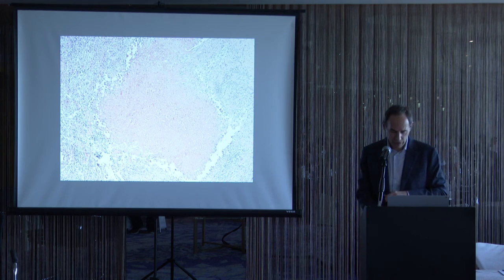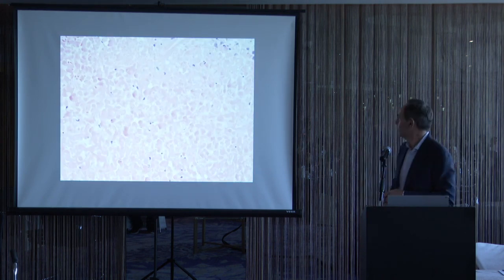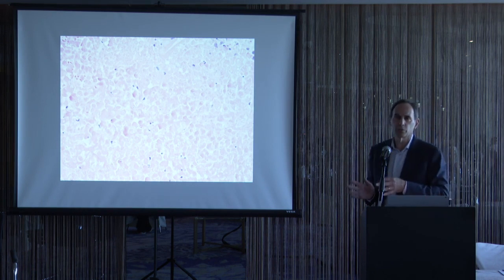Another case of necrotic seminoma. This one is a little bit more necrotic. It's harder to appreciate that these are seminoma cells. You wouldn't be able to make a specific diagnosis, but you should definitely be able to get to the point that this is necrotic tumor.